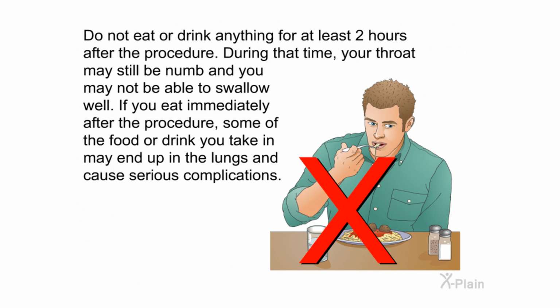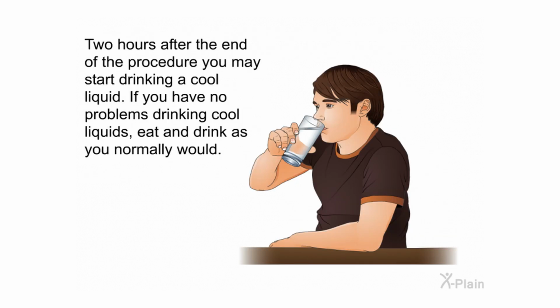Do not eat or drink anything for at least 2 hours after the procedure. During that time, your throat may still be numb and you may not be able to swallow well. If you eat immediately after the procedure, some of the food or drink you take in may end up in the lungs and cause serious complications. 2 hours after the end of the procedure, you may start drinking a cool liquid. If you have no problems drinking cool liquids, eat and drink as you normally would.